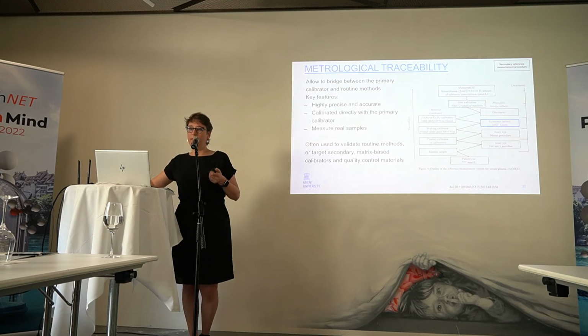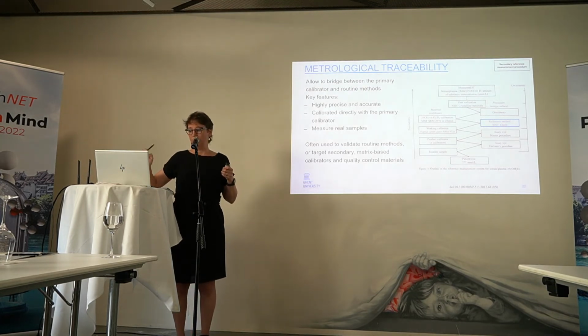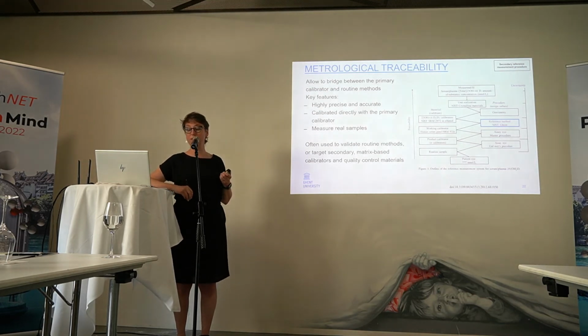So then there's another level in such a traceability chain, which is the secondary reference measurement procedures, and they allow to bridge between the calibrator and the routine methods. And the difference between just a routine LCMS procedure and a secondary reference measurement procedure is, as I already told you in the beginning when I introduced myself, a high demand for precision and accuracy, but it's also the fact that they are calibrated directly with the primary calibrator.